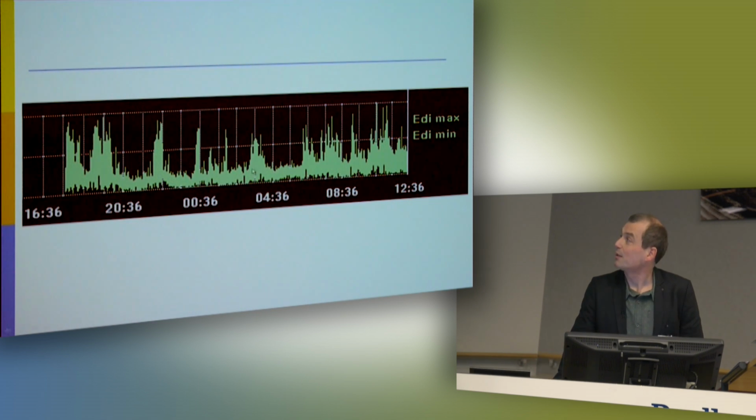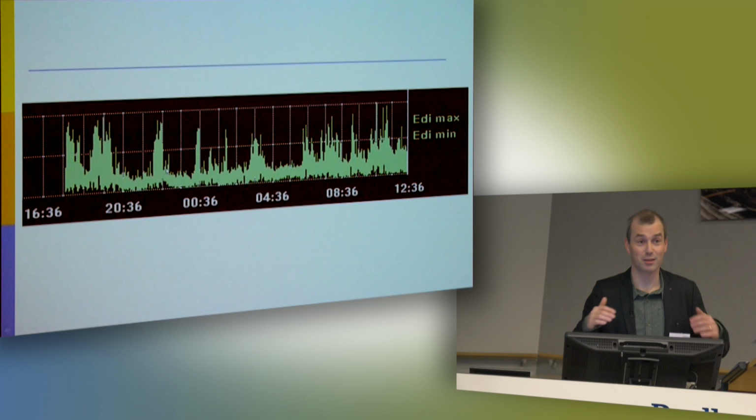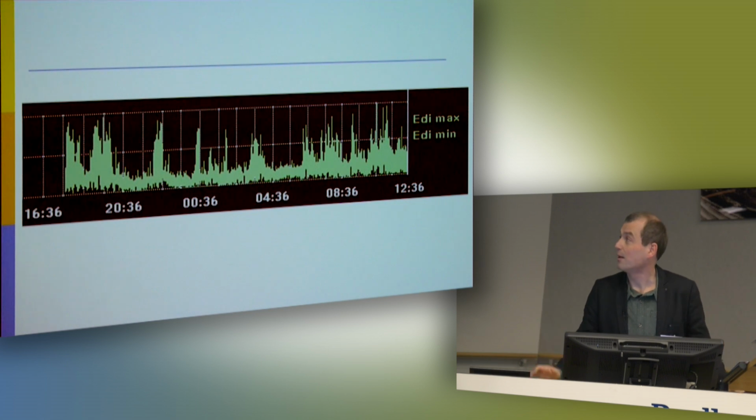I always wonder how we could manage this patient with a conventional ventilation, which always provides the same ventilation. It's probably not addressing the need of the patient all the time because these needs are changing all the time.